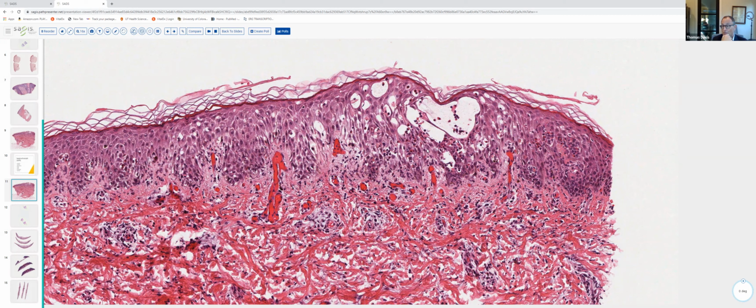Usually there's not much in the way of spongiosis with eosinophils. One sees striking dyskeratotic cells within the hyperplastic epidermis, and sometimes those dyskeratotic cells actually calcify. So again, we have another example of a condition which starts out as a spongiotic dermatitis, but in the late stage shows psoriasiform epidermal hyperplasia.